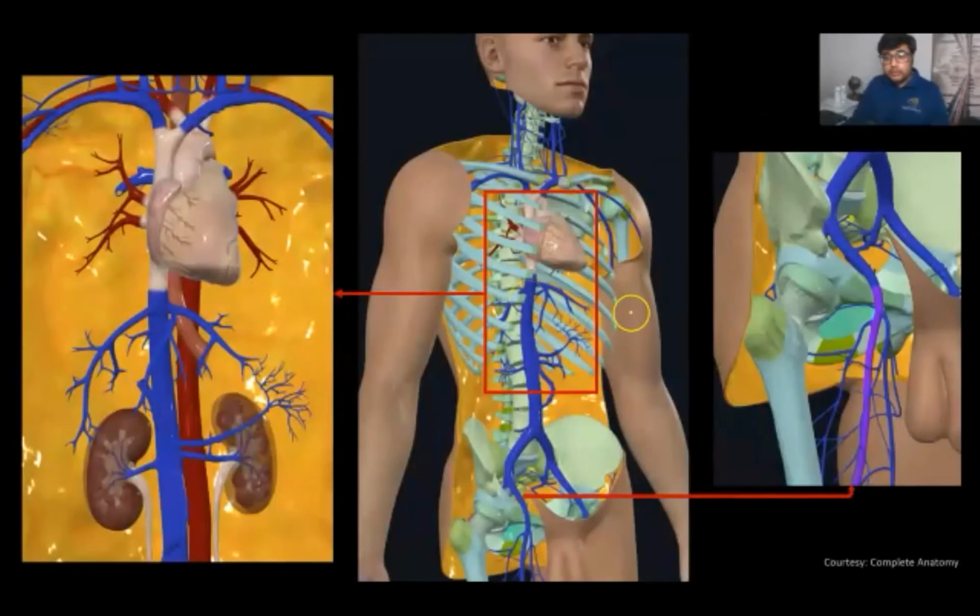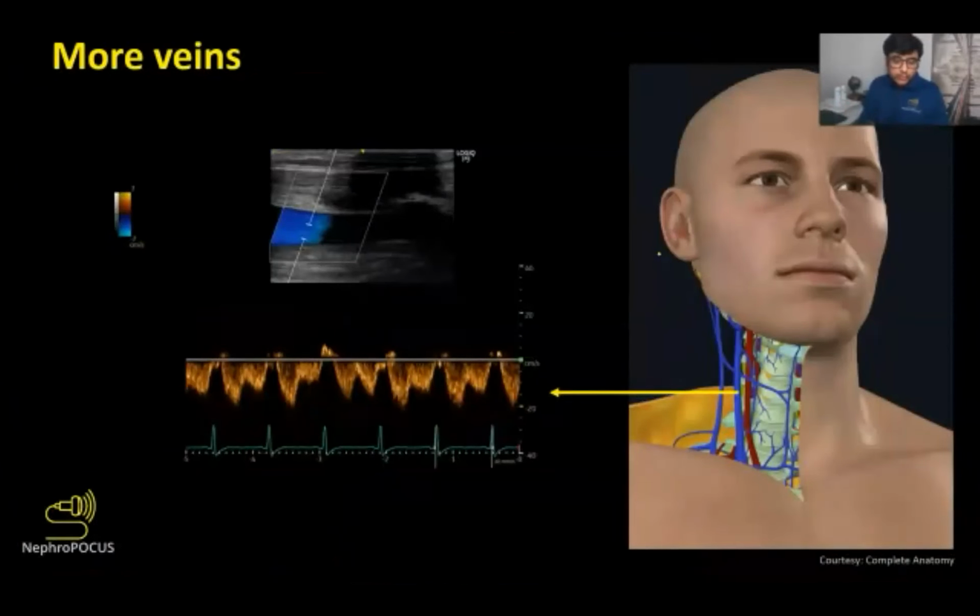Also, femoral vein waveform is a little bit less sensitive for right atrial pressure because it's farther from the heart, right? Here is the right atrium with high pressure. So hepatic veins and portal veins are much closer, like intrarenal vein also closer to the heart compared to femoral vein, which is somewhere here. So it's less sensitive, though it's a little bit more specific for right atrial pressure.